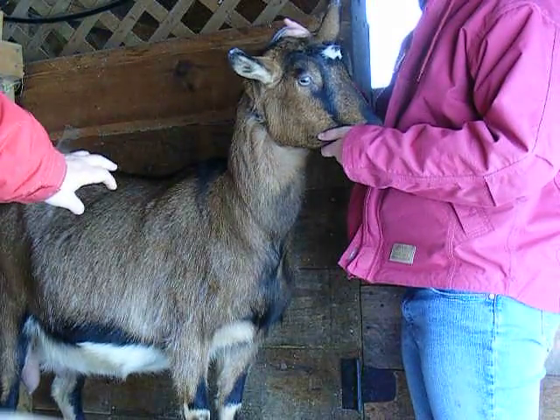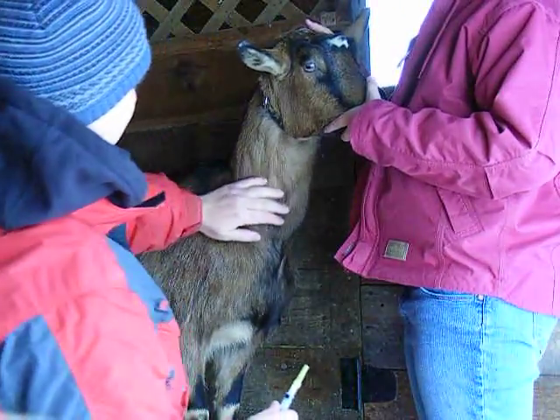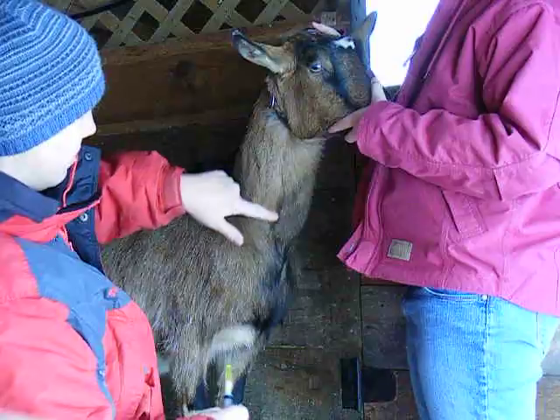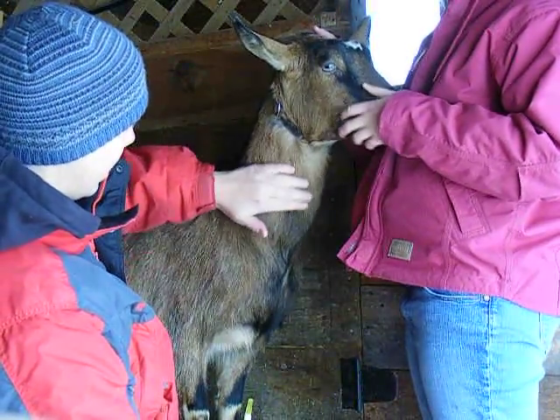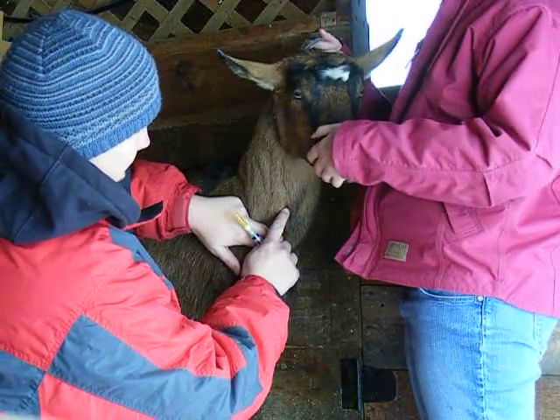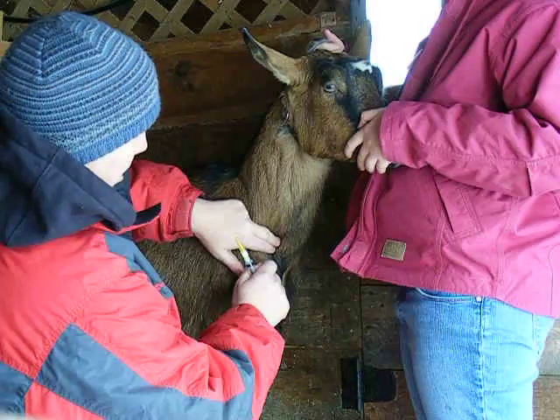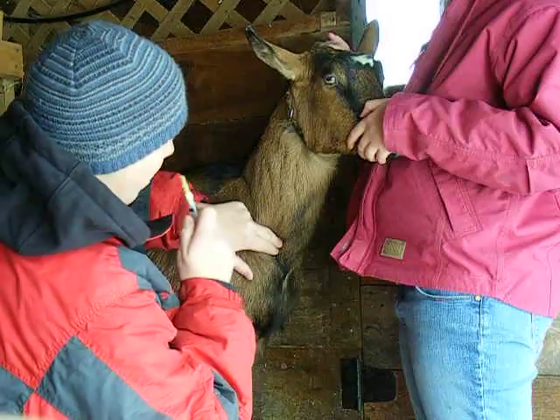We have a 6cc syringe and a 20 gauge needle that's an inch long. We're going to be drawing blood from the jugular vein, which runs down here from about the jawline down. You have to apply pressure to the vein so that you can see it swell up. You can almost see it when I let go and it drops back down — that's where we're going to draw blood from.